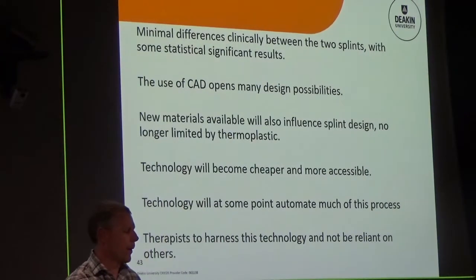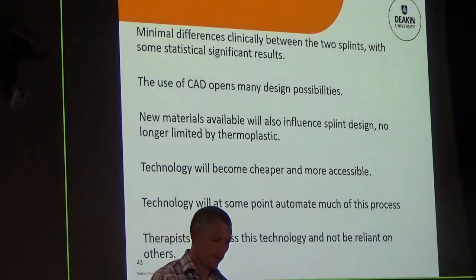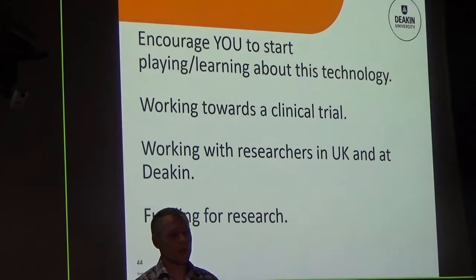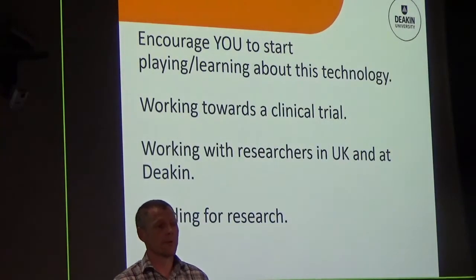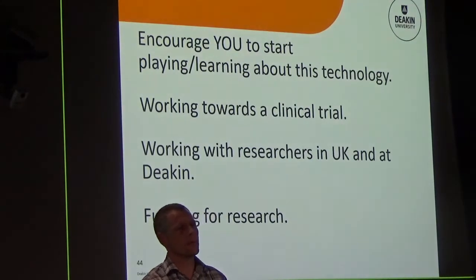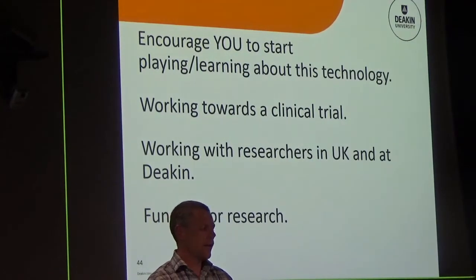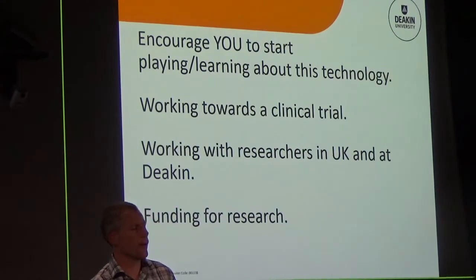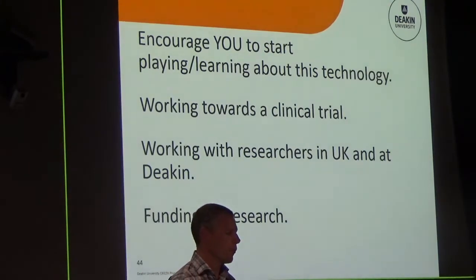So that might be part of clinical trials, or in yourself thinking through technology and what it might be good for. So playing around, just learning it. If you did get a chance to download the apps on your phone and literally just play around, even for assessment, you can scan someone's finger in a clinic just for fun and keep that on file. You might say that there are edema changes, that volume's different, anything like that. So just something to play with more than anything.